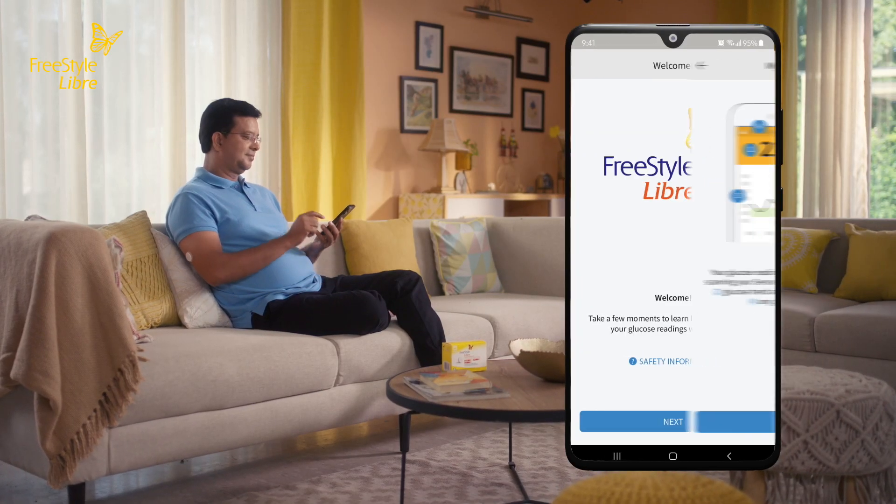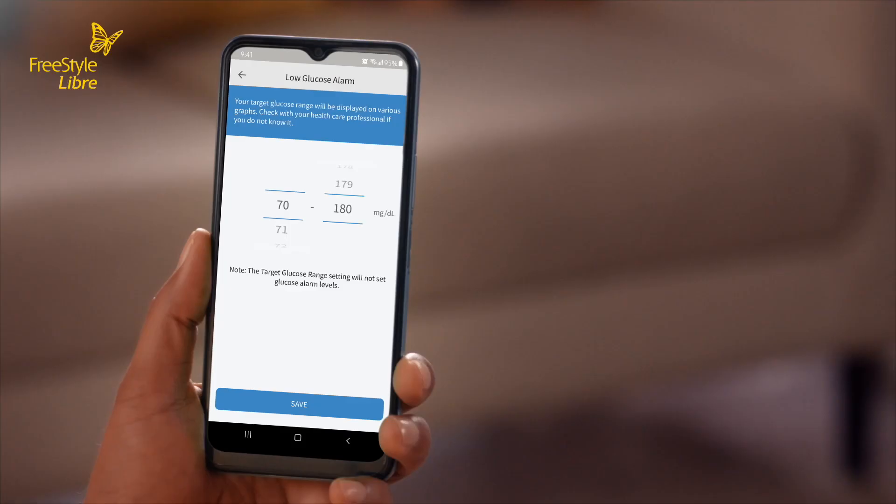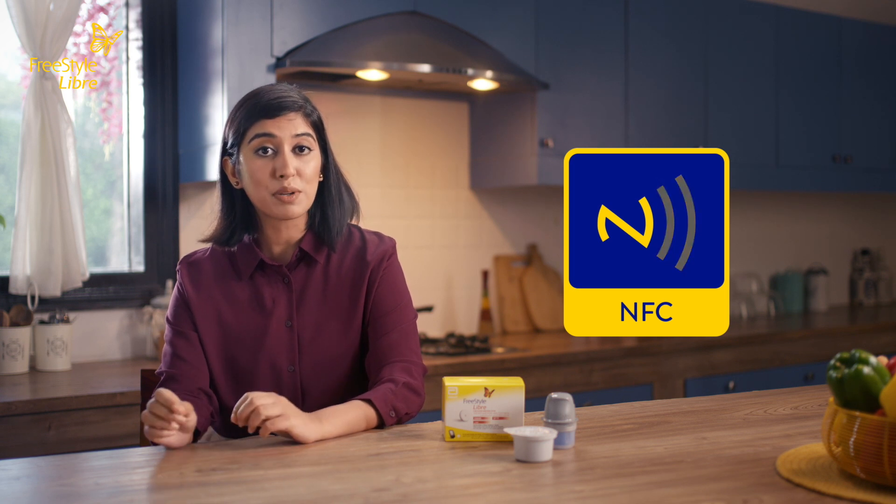Next, you will see some helpful screens that will guide you through the app. Complete the setup by setting your target glucose range as recommended by your doctor. Make sure that the NFC function is enabled on your phone before scanning the sensor. Follow the steps to set it up and activate it.